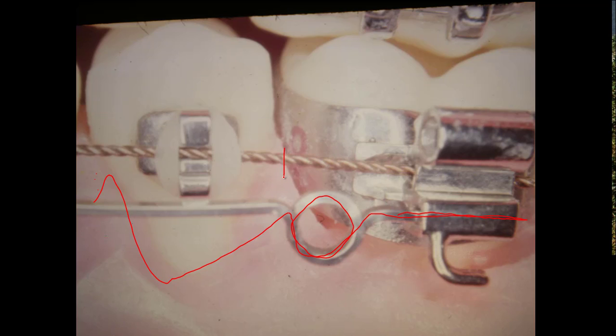Something I forgot to tell you: once you get enough space in the arch for all the teeth to line up, you should come in and put some type of tie-back in the arch wire. Convert the spring into a tie back and come in and tie this arch wire back to the molar. The arch wire has to be tied back real tight. Then you don't have to worry about torquing them too much — you just intrude them. They can't jump forward because the whole arch is tied together.